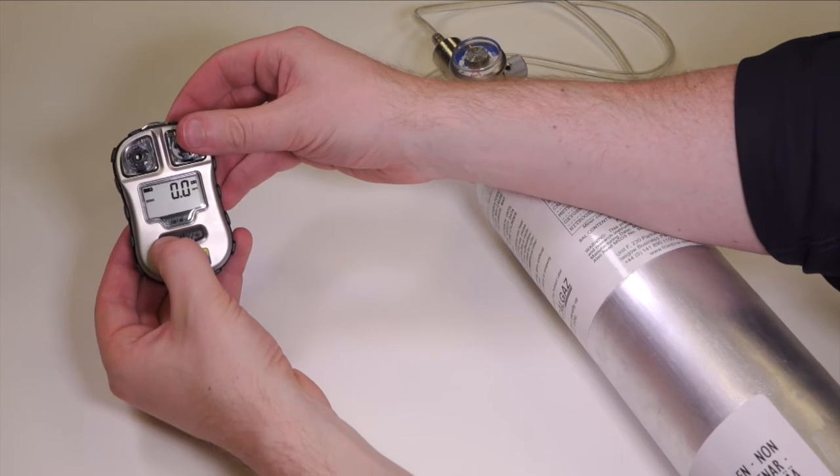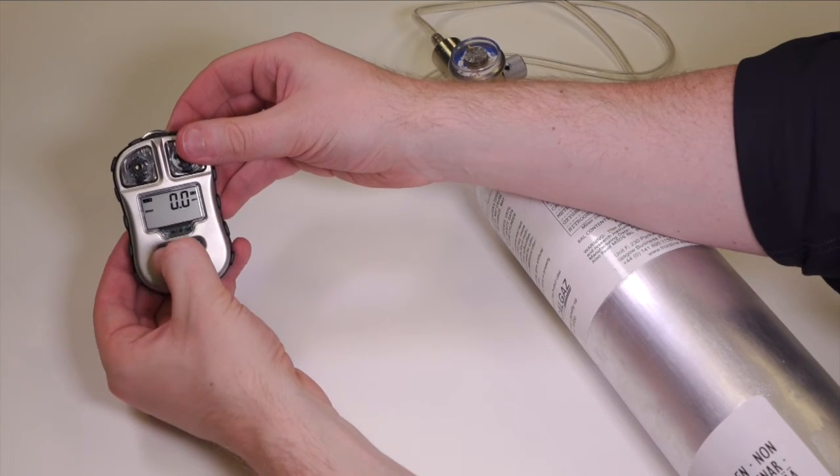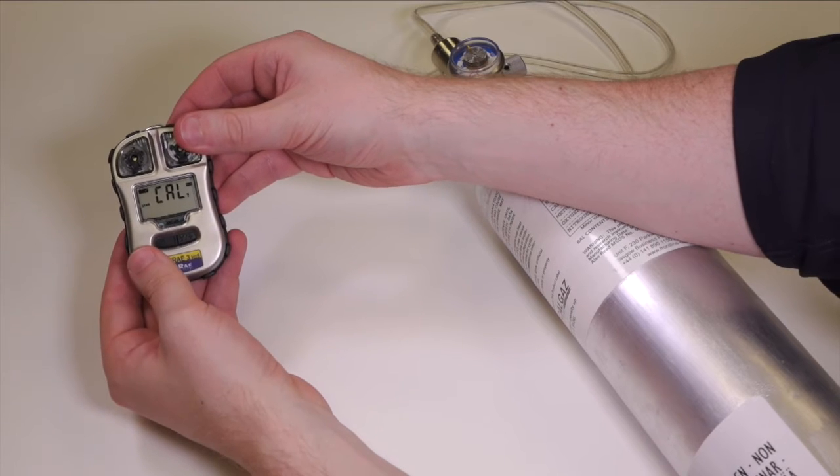So the zero cal is complete, just acknowledge that by hitting again the left hand key and it's now asking us if we want to do the span cal.